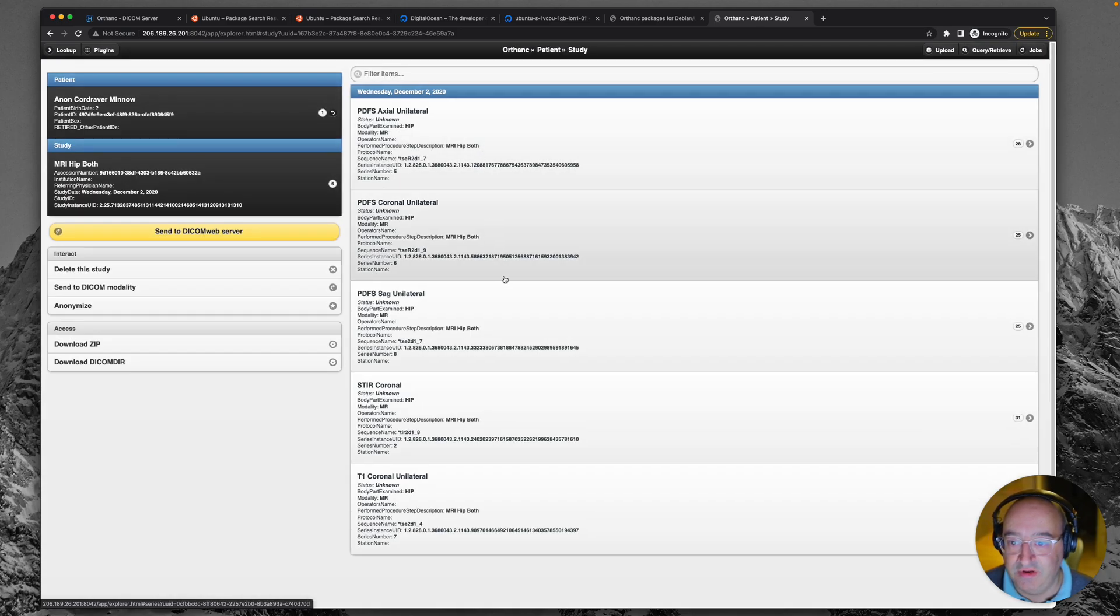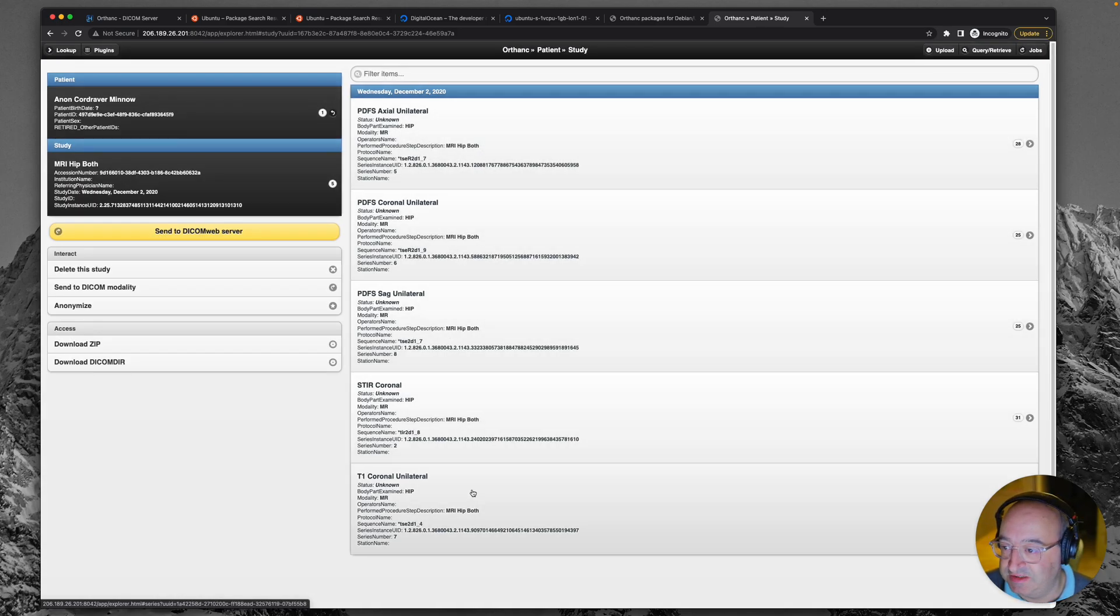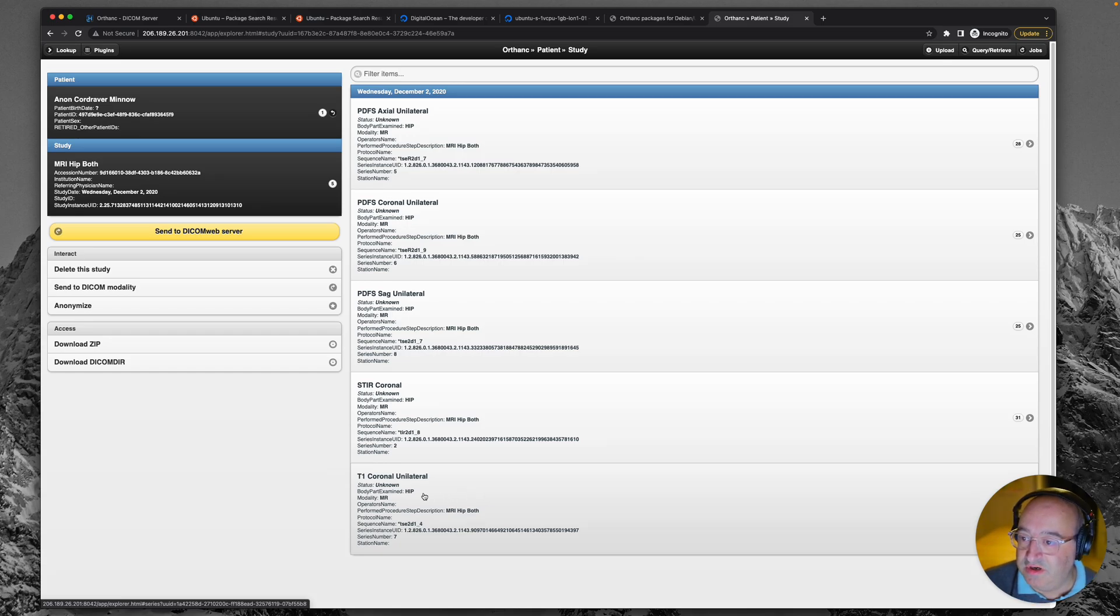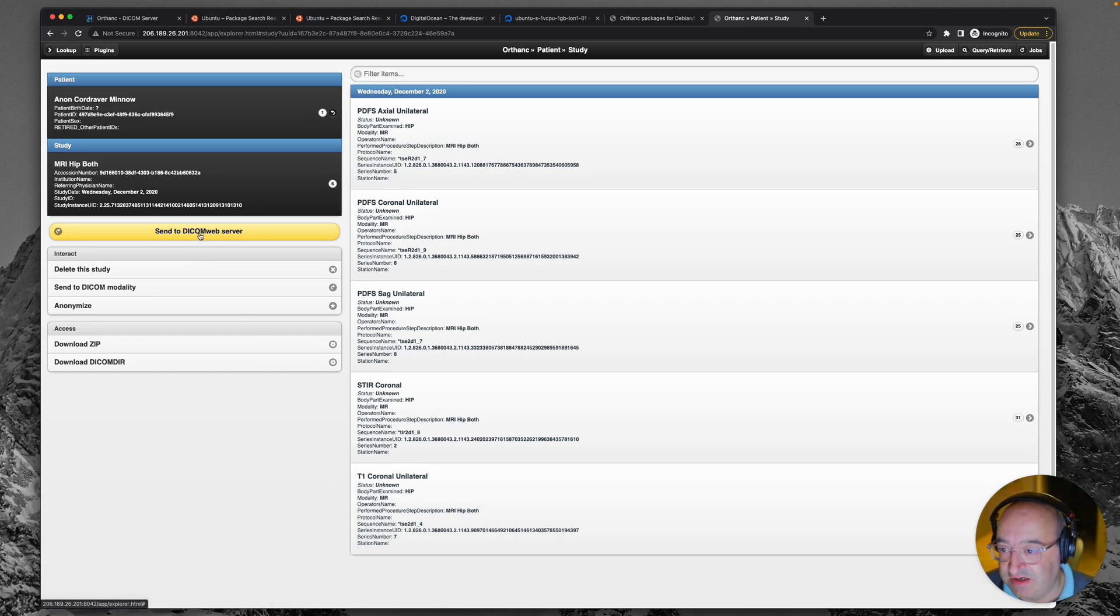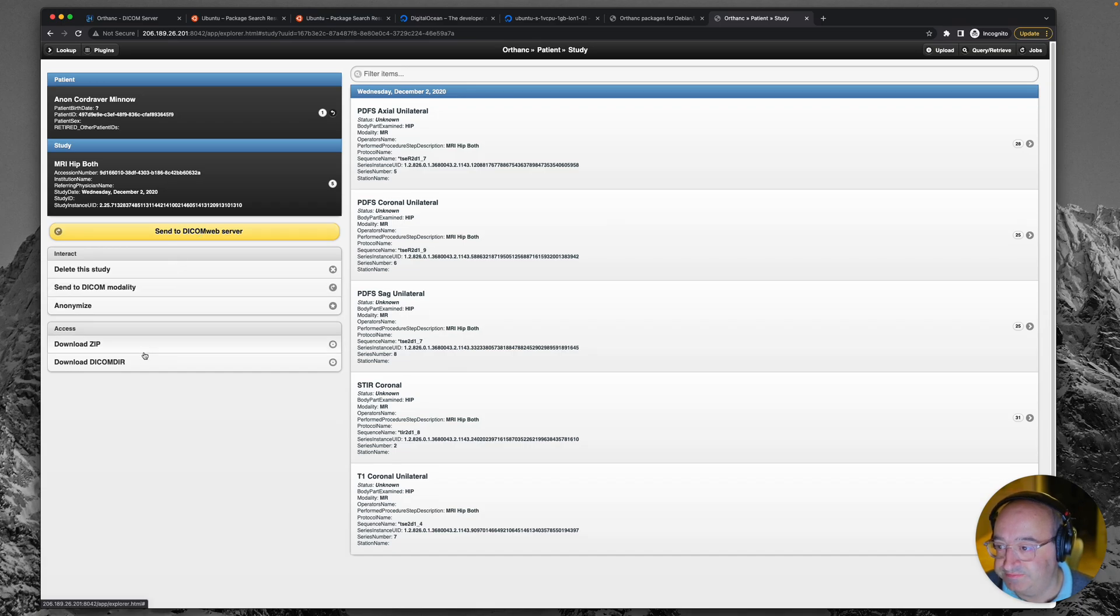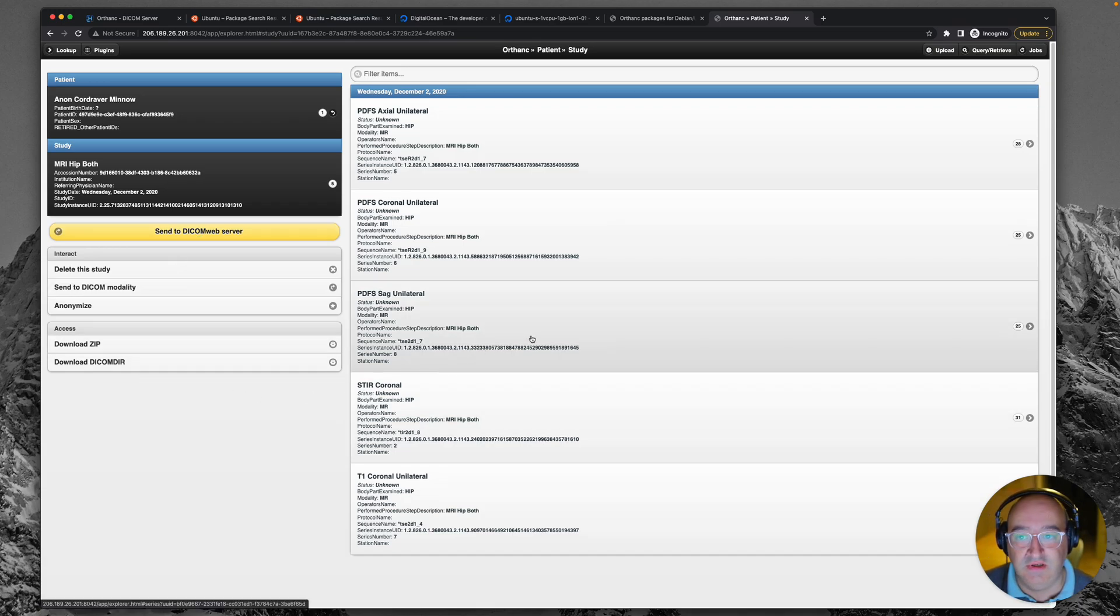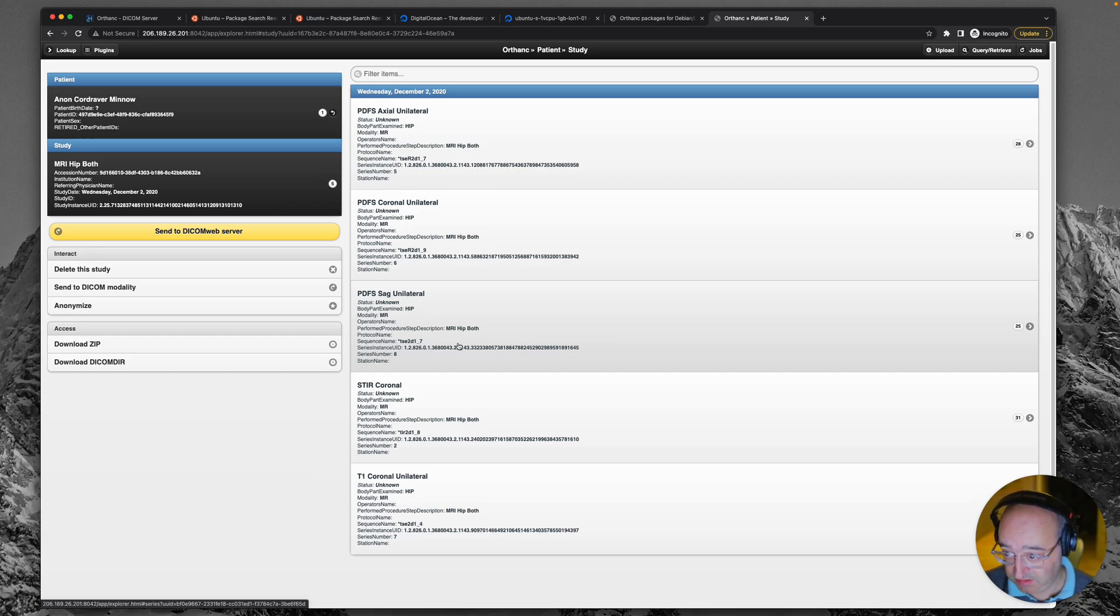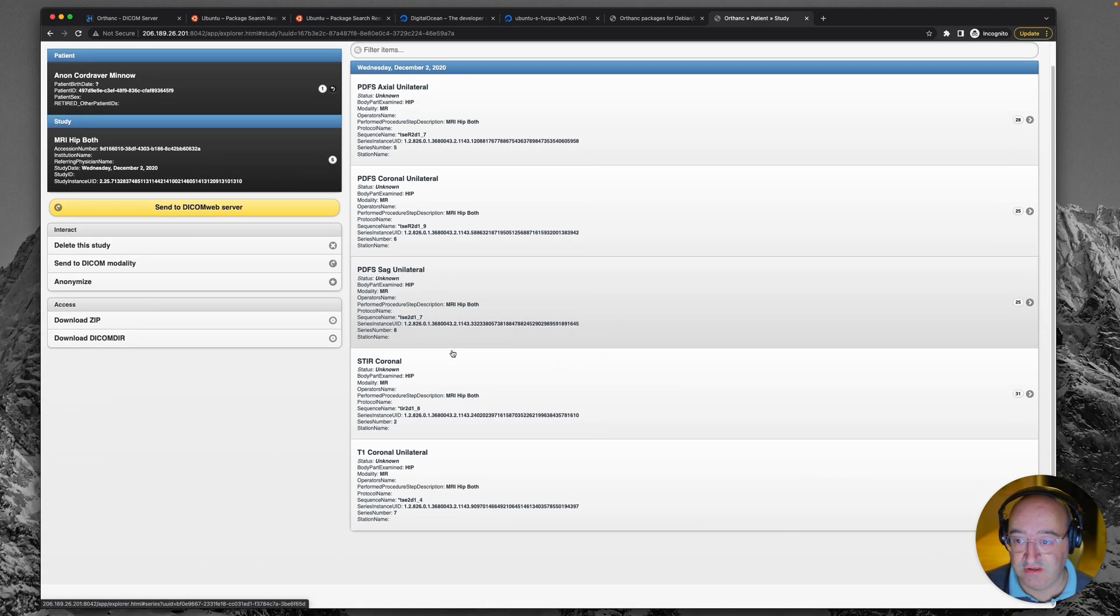We click through and yeah, there are the series that we've uploaded. So what can we do? We've got send to DICOM web server, but have we got a viewer?